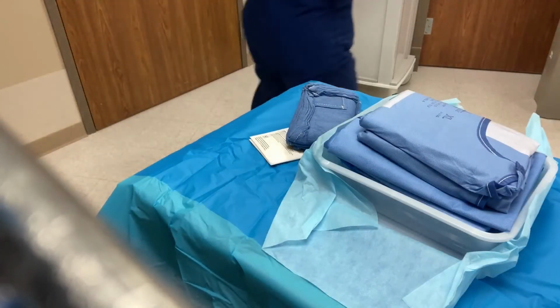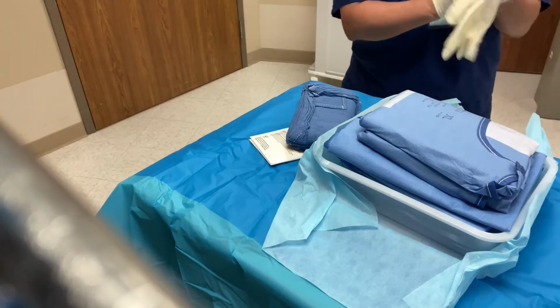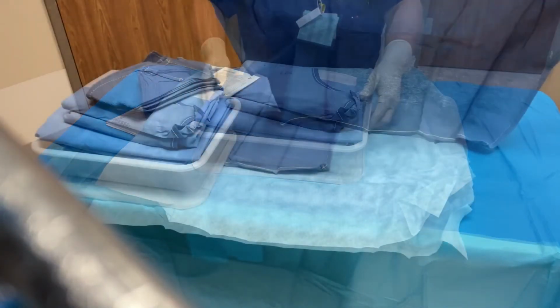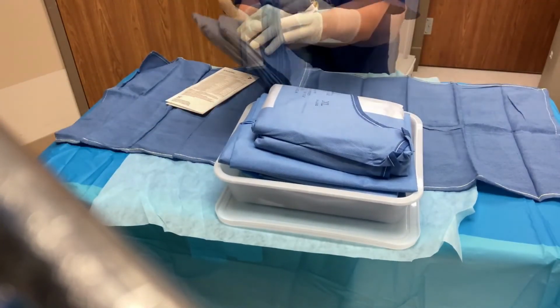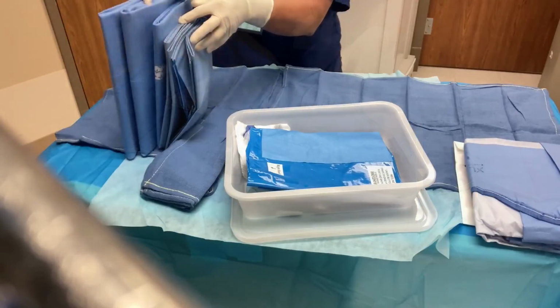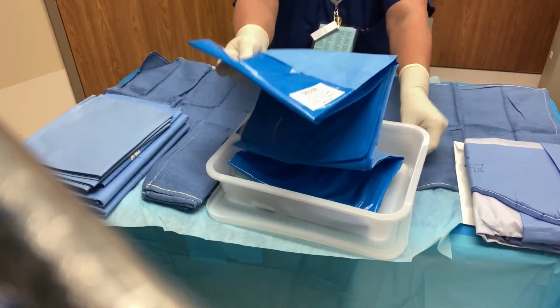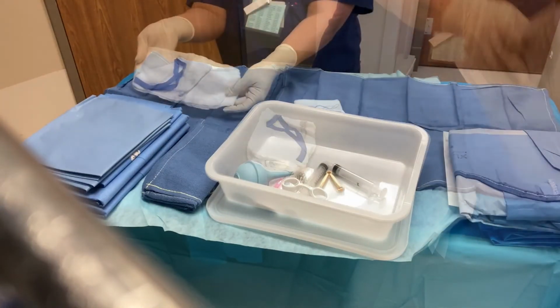Sandra, with only her body and navy blue scrubs seen on screen, walks towards a delivery table. As she moves, she gloves her hands. An open package of blue-colored drapes and vaginal delivery supplies sits on top of a blue sterile table cover. She unfolds 2 blue sterile towels covering the entire table. The leftover blue towels are placed next to the white plastic placenta basin, and removes the various gowns, drapes, and towels from inside the plastic basin. The basin is placed on the mid-upper quadrant of the table. Gowns and drapes are split up and go on opposite sides of the placenta basin.